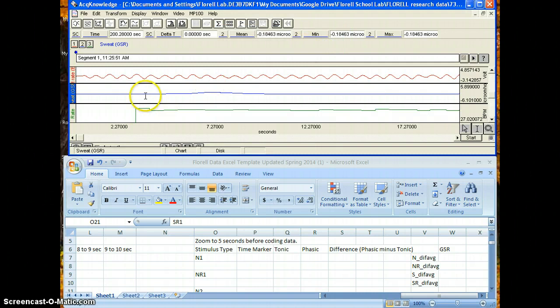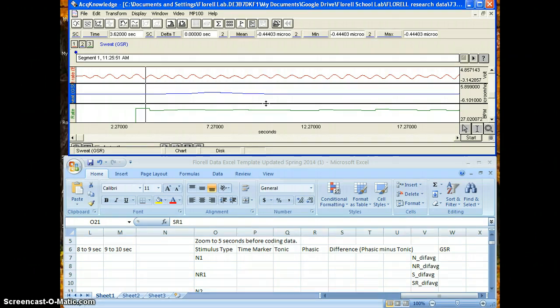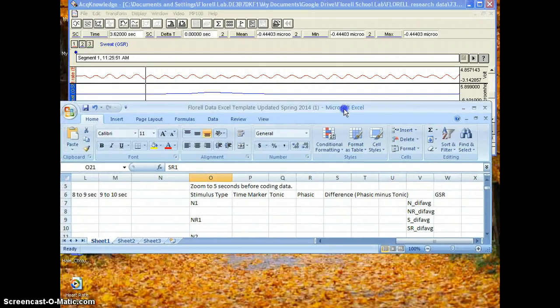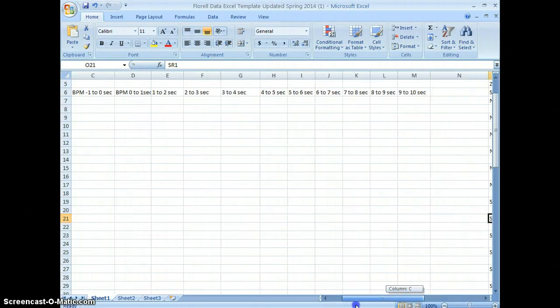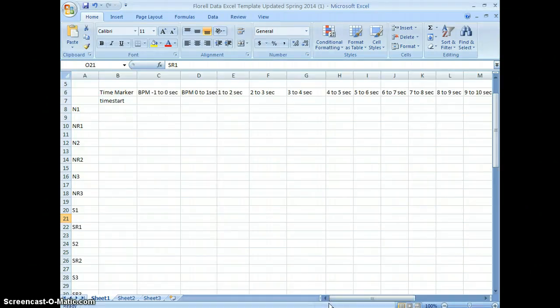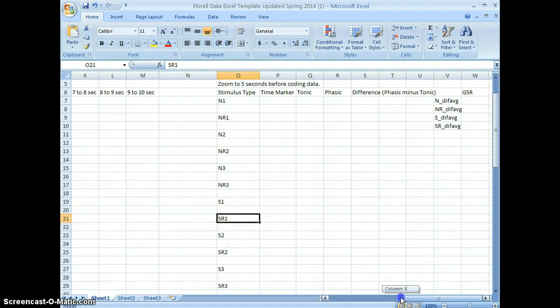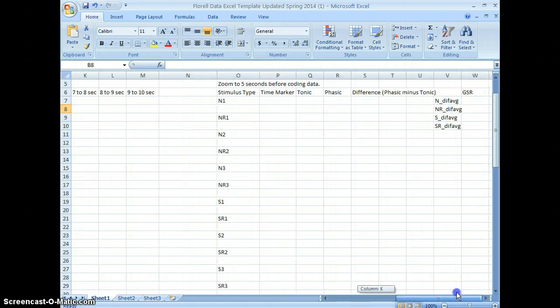So now we need to find the time marker numbers from the Excel file to know where to start coding the GSR data. Normally, you know, this will be filled out too for you, but just in case it's not, the time marker number is the same marker that would normally be here after the heart rate's been coded.